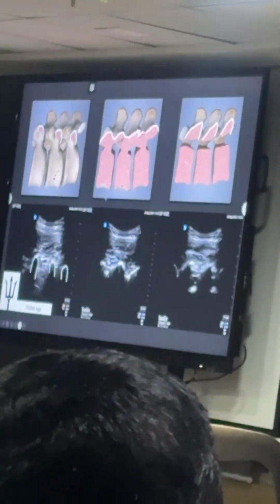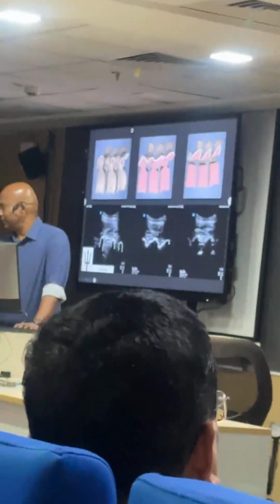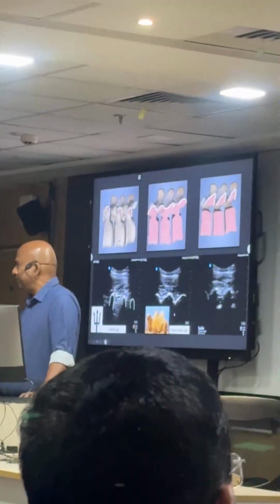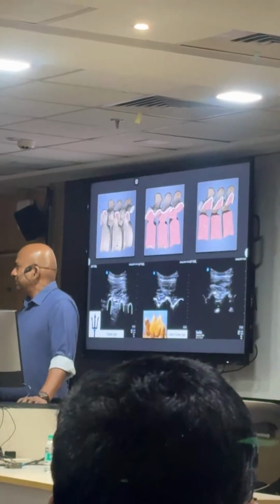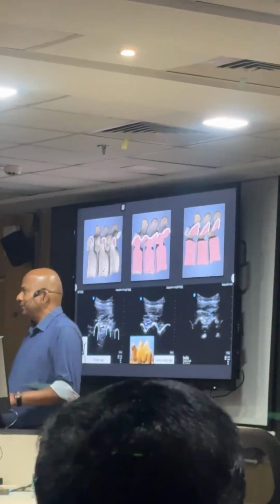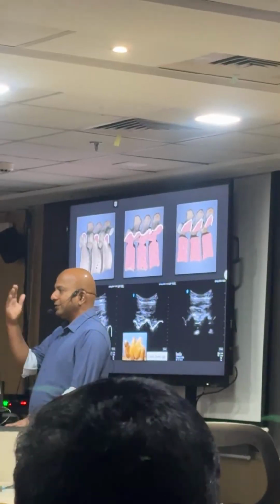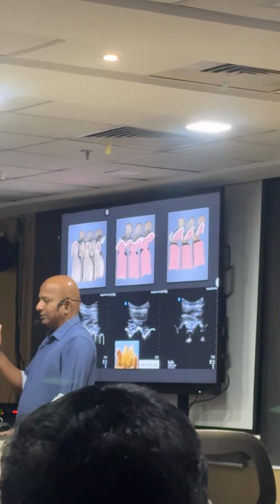So from there, if you arrive at the articular process, this intermittent line is going to become a continuous line. Since it looks like the hump of a camel, it's an imagination of the first describer, so that it's ups and downs, but it's continuous. So they called it a camel hump sign. Whenever you see a trident, you should know that you are at the tips of the transverse process. When these lines become continuous, you need to understand you have arrived at the articular process.